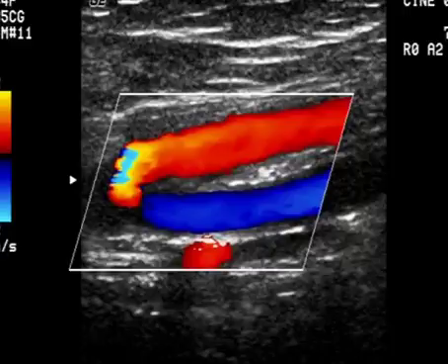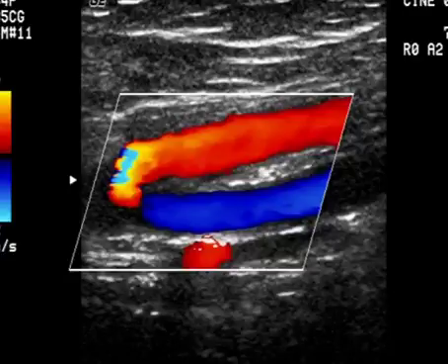In this image, we see some color flow added on, and the color filling right out to the vessel walls. And again, no plaque visualized. We've got good color filling. But what's going on in this patient is something a little bit different.